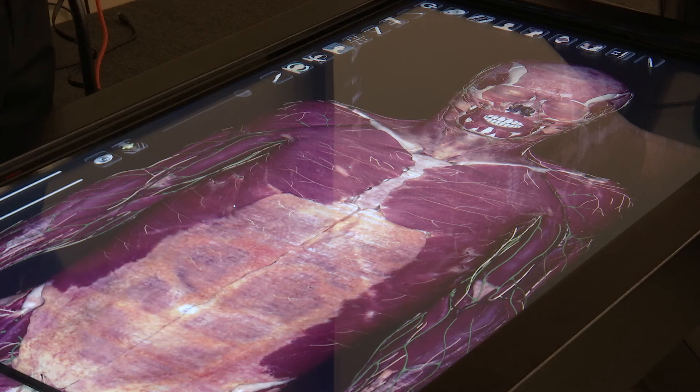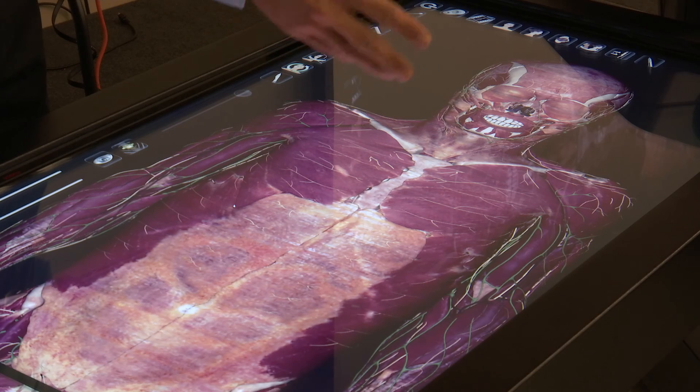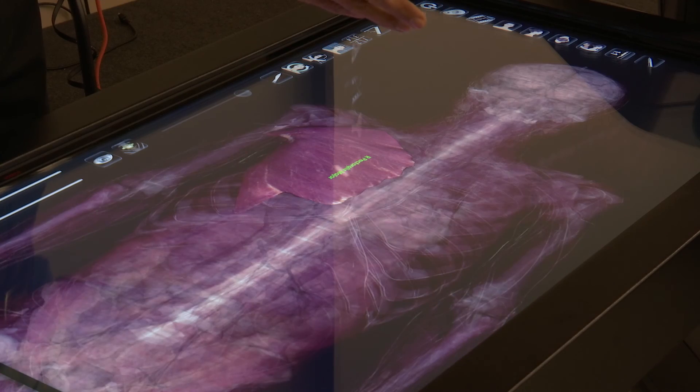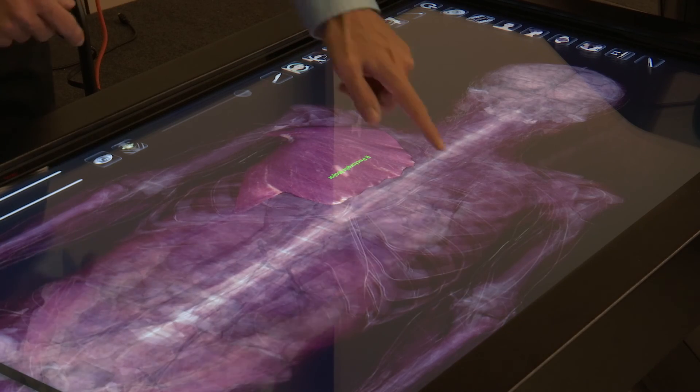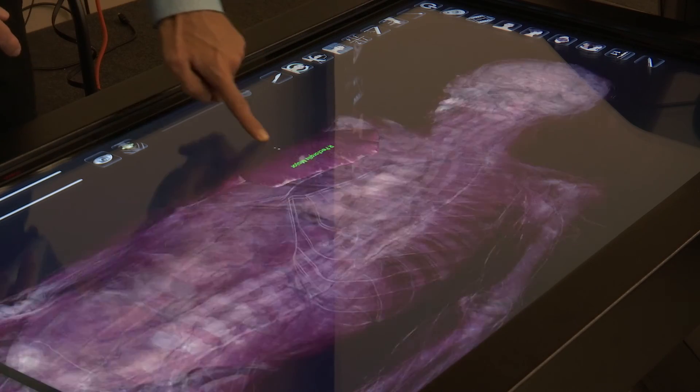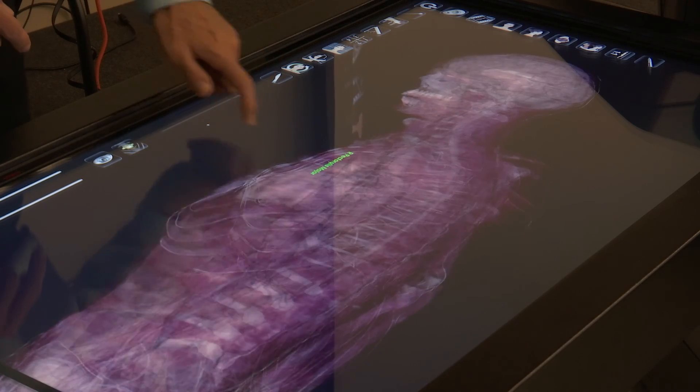What the anatomized table is, it's a virtual dissection table. This allows us to dissect the body in 360 degrees.